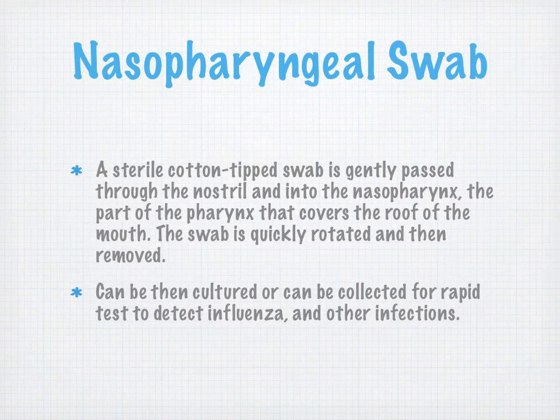So a nasopharyngeal swab, again, a sterile cotton tip swab. Remember the nasal swab previously said cotton wool. We can discuss the difference between cotton and cotton wool if you don't know that already, or you can just Google it. That's what I'm going to do, just to remind myself.